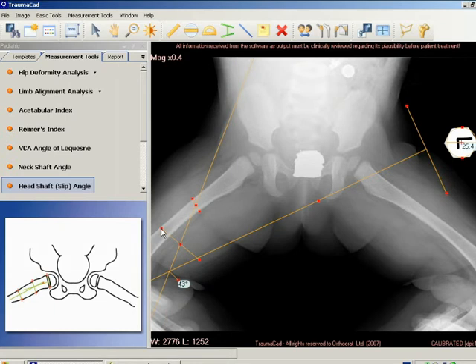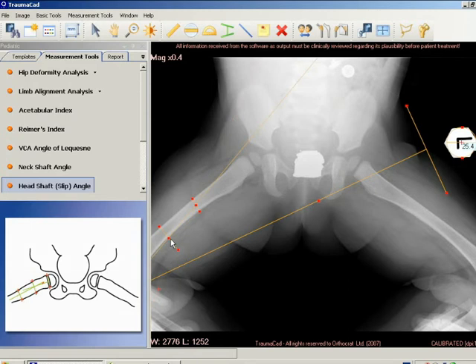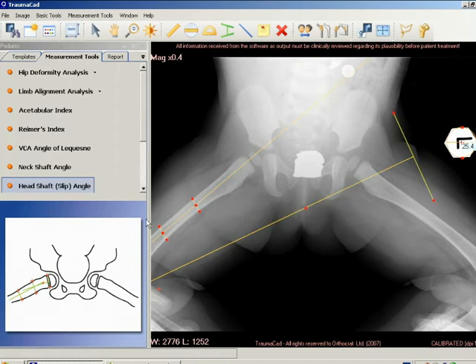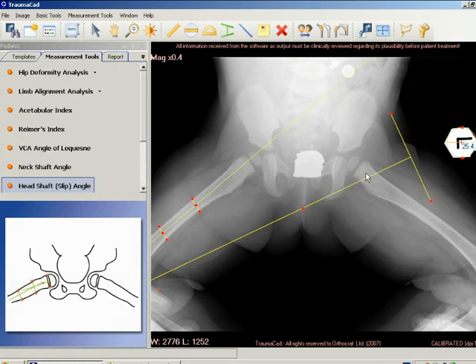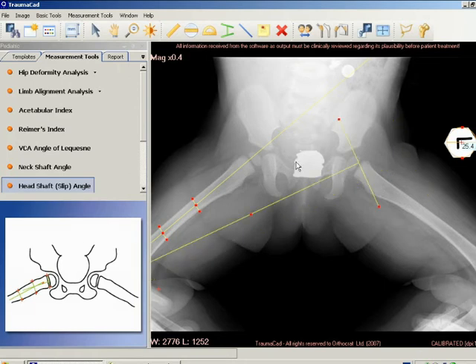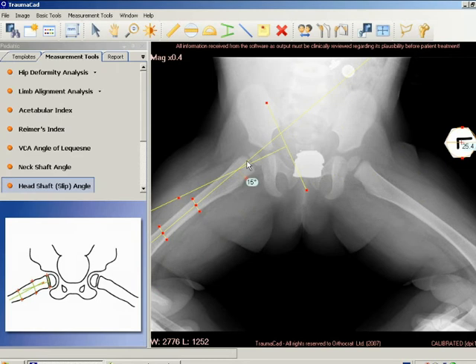A line is drawn between the anterior and posterior tips of the epiphysis at the physeal plate level. Then a perpendicular line is drawn to this epiphyseal line. Next, a line is drawn along the mid axis of the femoral shaft. The epiphyseal shaft angle is the angle formed by the intersection of the perpendicular line and the femoral shaft line.